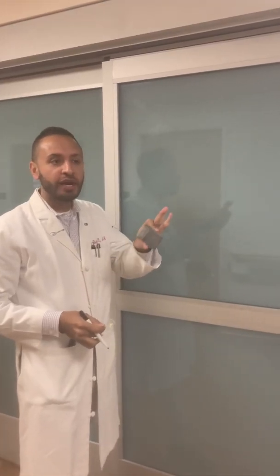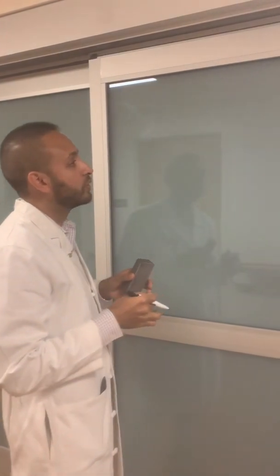That was how we interpret the ICP waveform. It's very important that you not only look at the number, but also look at the waveform, because you can say, hey, listen, that P2 is higher, my patient is a little sicker today, or can't take a joke today. Now, you're gonna have issues with your EVDs. It's normal. You have to figure out what's going on.